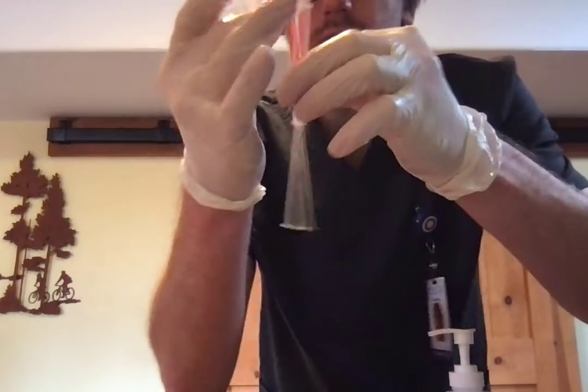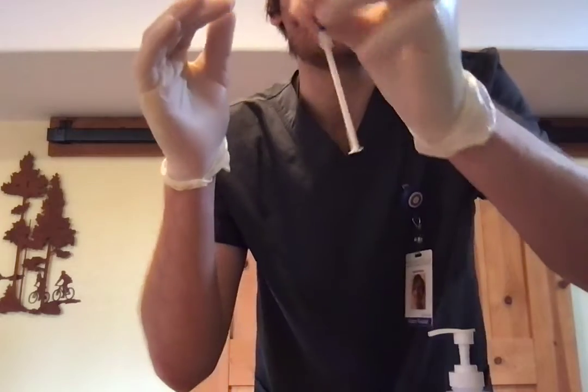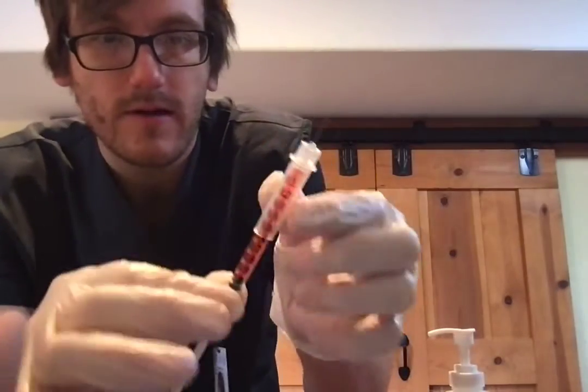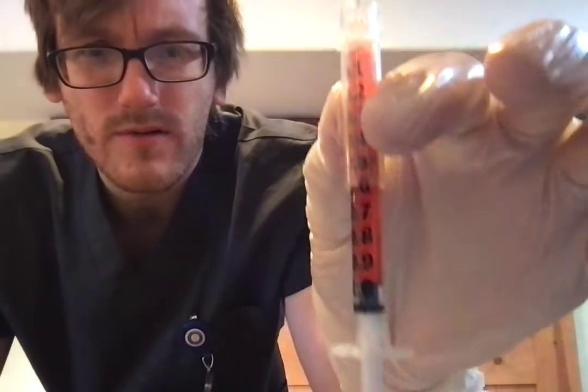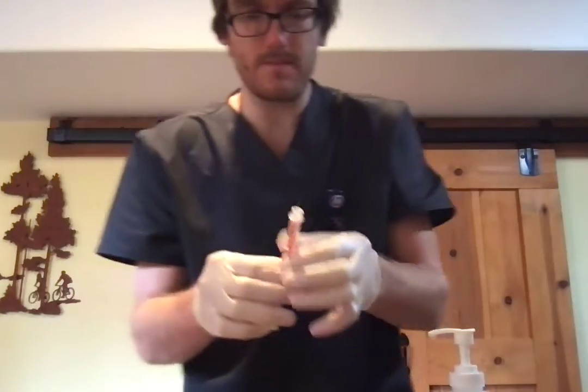I want to inspect for any bubbles, give that a quick tap, make sure that there's no air in there, and then I just want to let y'all see what we've got going on here. There you go, hopefully you can see that.